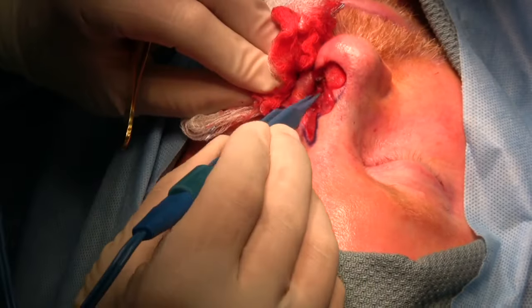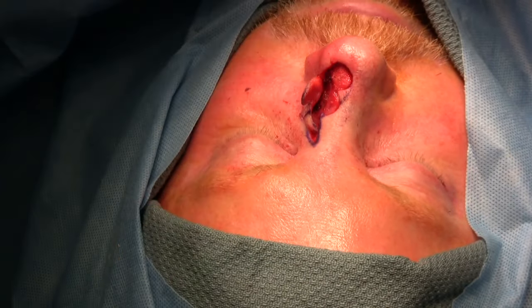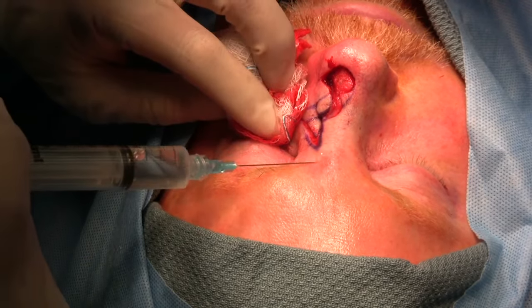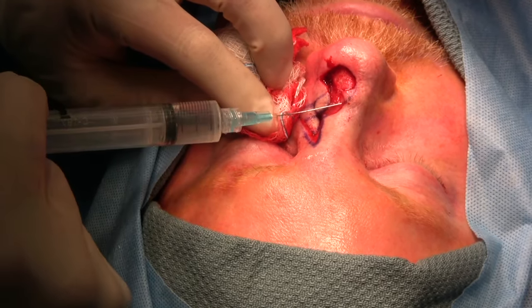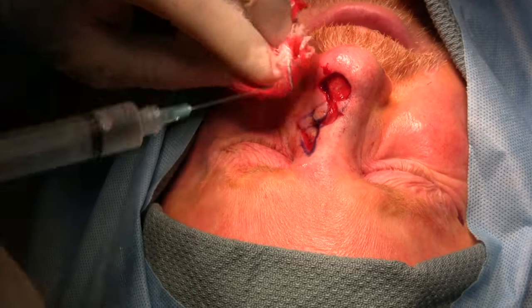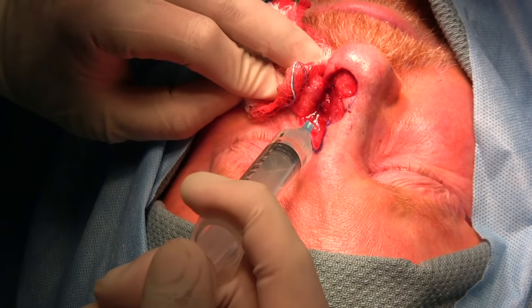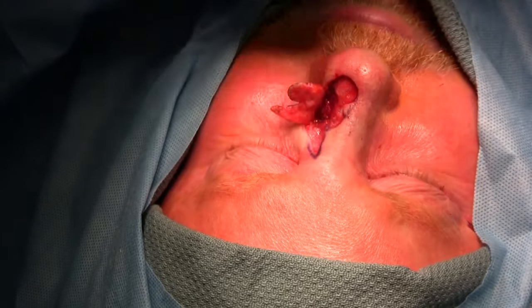I'm going to give you a little more medicine — a little more local, please. That's a little pinch over there; I'll give you some more numbing medication right there. That's numbing medication going in, so now you won't feel anything.